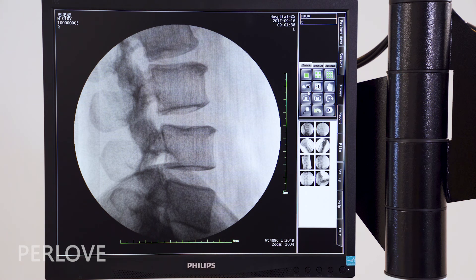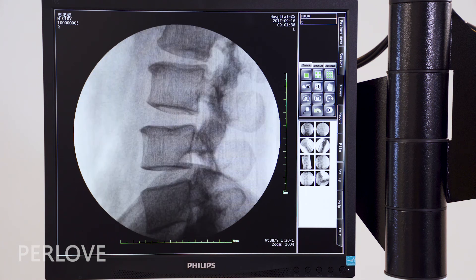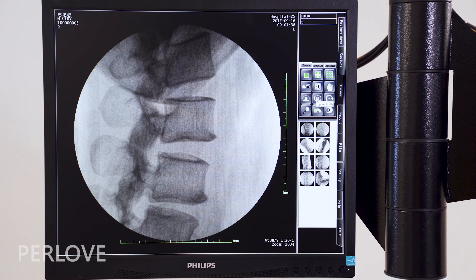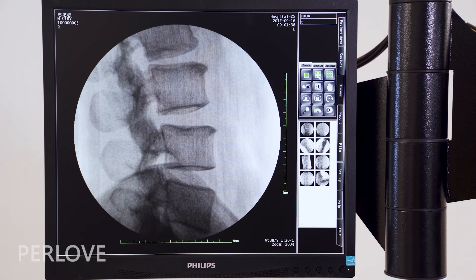For image processing, you can realize four windows, nine windows, sharpening, horizontal mirror, vertical mirror, text annotation, lens measurement, and more.